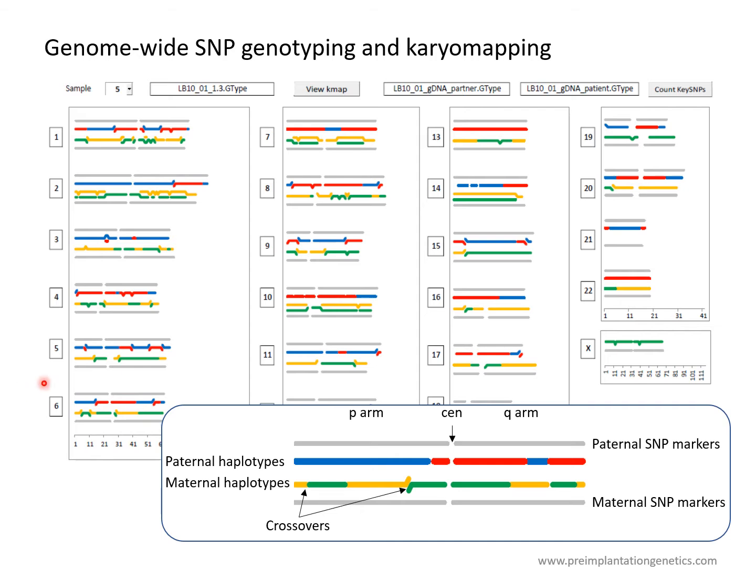You can see various examples of that, particularly here, where instead of having a single chromosome with recombinant regions of the different haplotypes, we have both maternal haplotypes present over this region of the chromosome on the short arm and this region on the long arm, indicating the presence of 2 distinct maternal chromosomes due to a meiotic error.